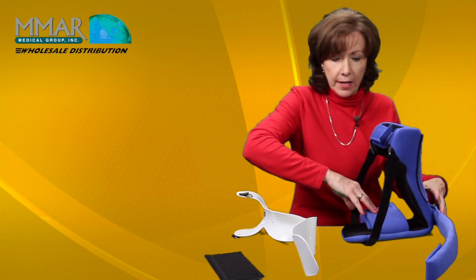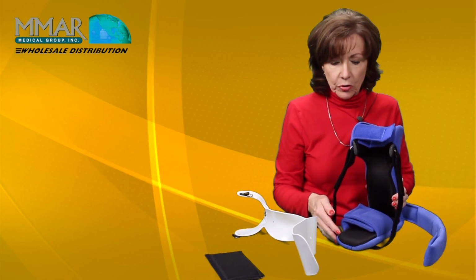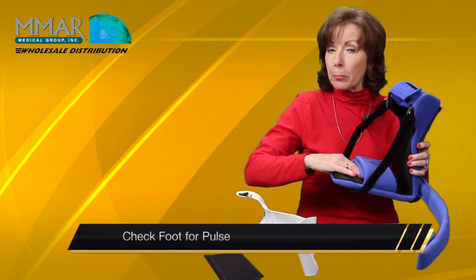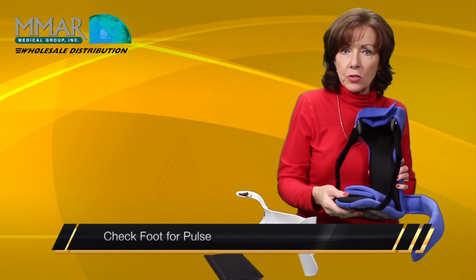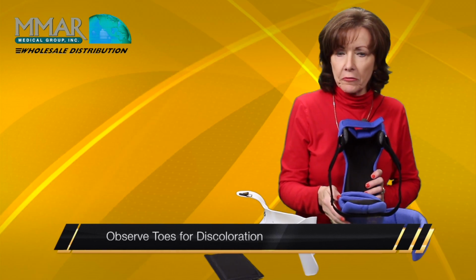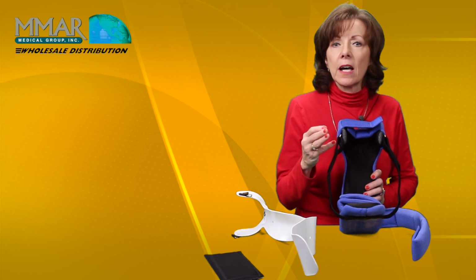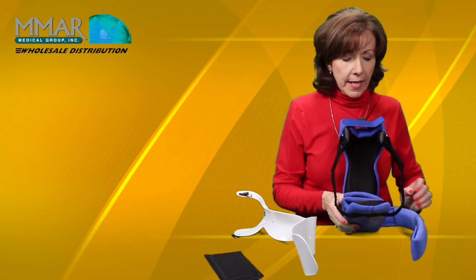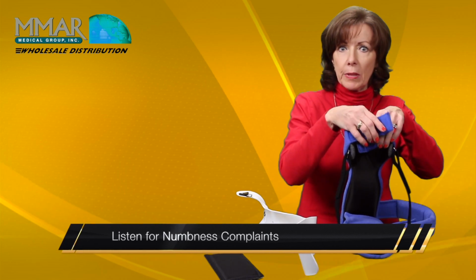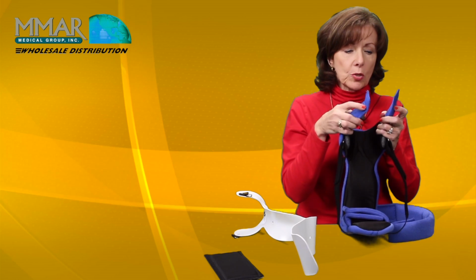and snug that around. Now I'll take my finger and go under the padding to make sure there's no pressure. I'm going to feel the top of their foot and make sure I feel a pedal pulse. And I'm going to watch their toes, just notice them every few minutes, to make sure they're normal color, they're not blanching, they're not swelling, they're not red. And if the patient complains of any numbness and tingling, we're certainly going to pay attention to them. You would immediately loosen the straps.